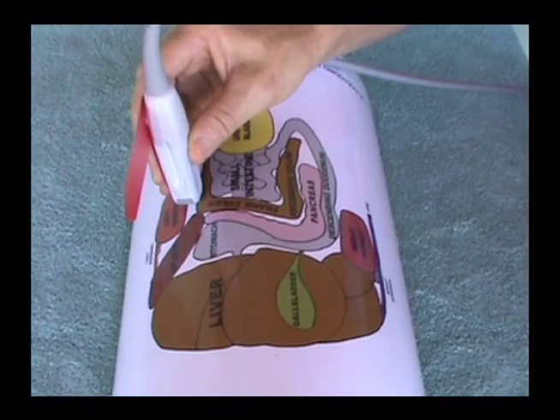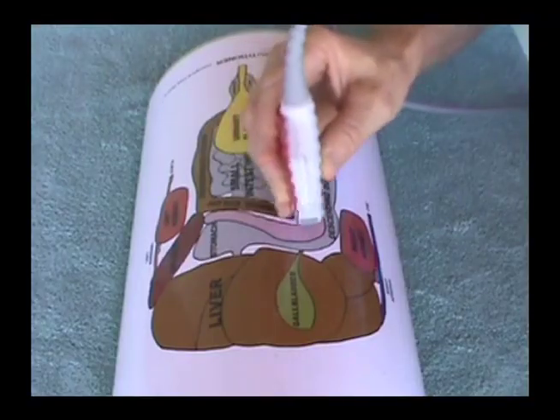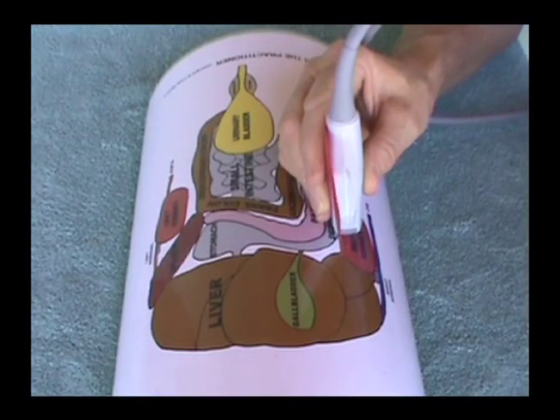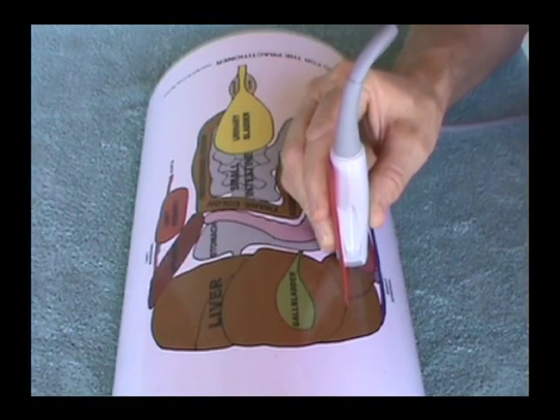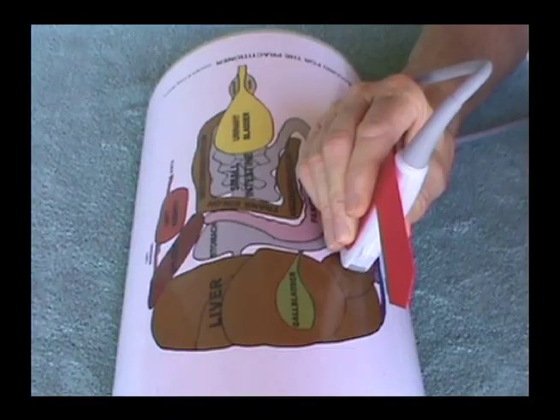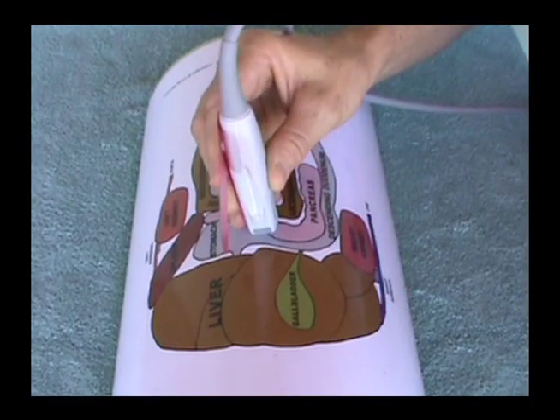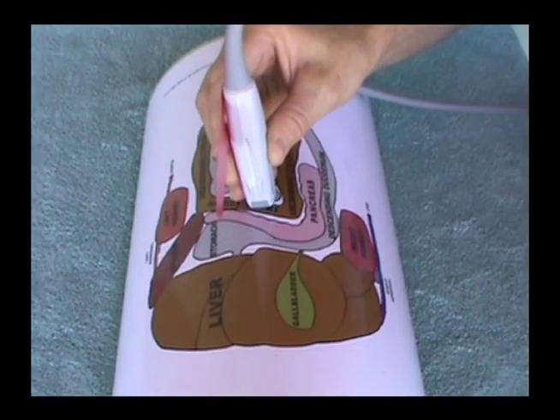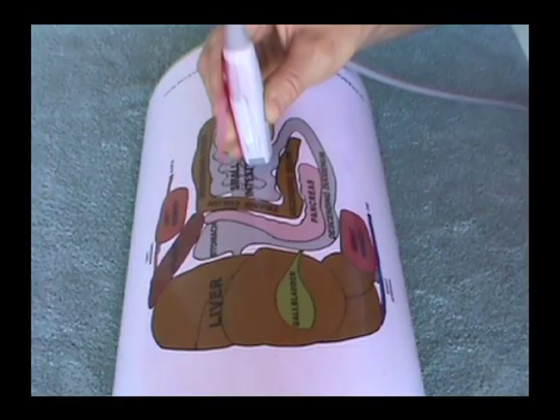Occasionally it may be preferable to place the transducer along the left or right ventral sagittal plane to view kidneys or adrenals. To standardize images, the index indicator will always point toward the patient's head in a sagittal plane.